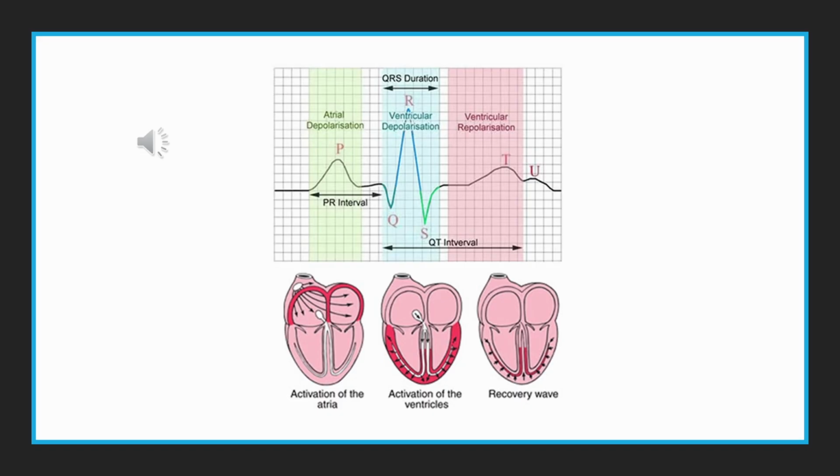And then we also have the U wave. If it's present, it's not always seen, but if it is there, then it may be reflecting that there is some repolarization of those Purkinje fibers or the bundle cells. A very prominent U wave may mean that we have hypokalemia.